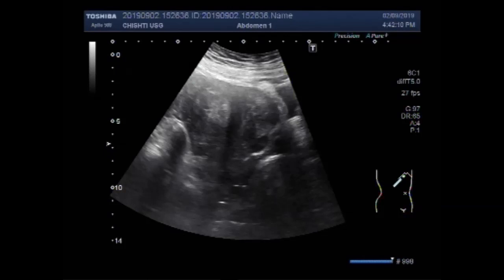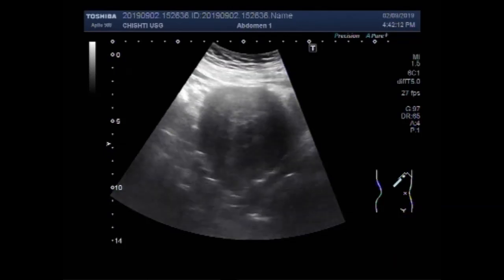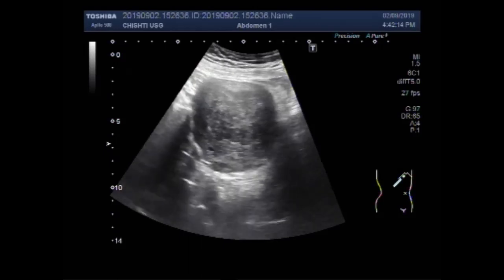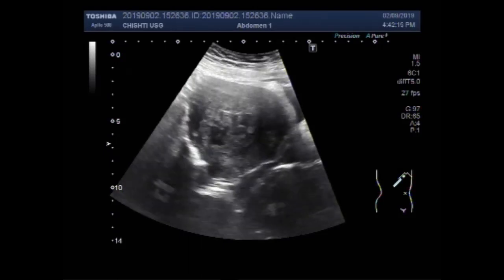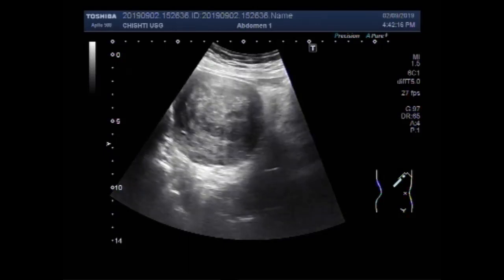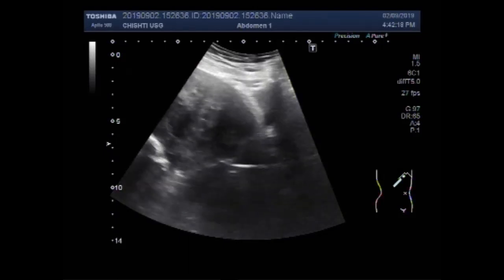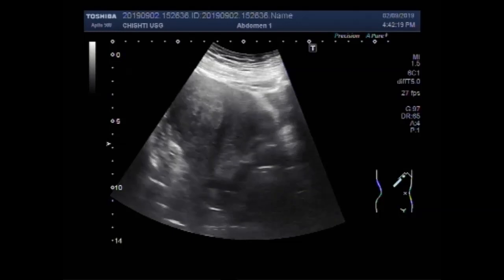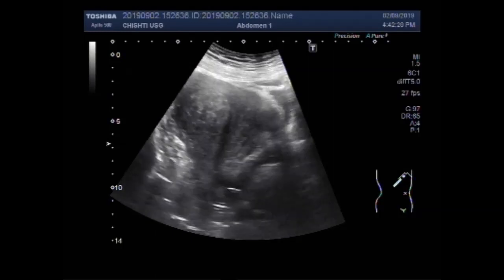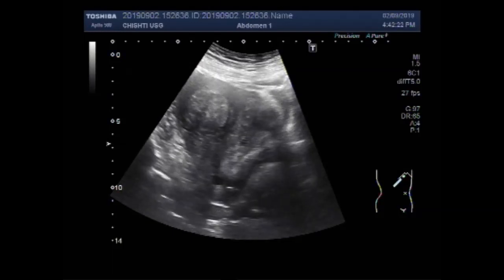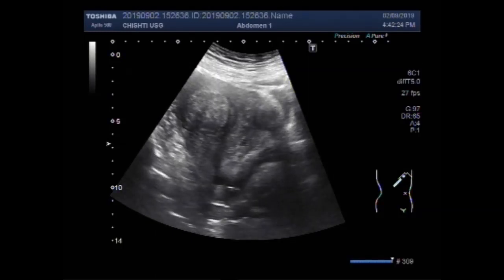Dear viewers, I hope you are all fine. This ultrasound video shows two large fibroids in the uterus with a smaller uterine mass.